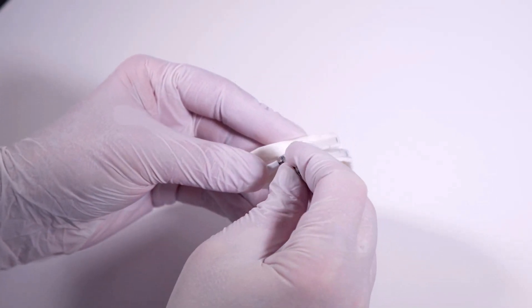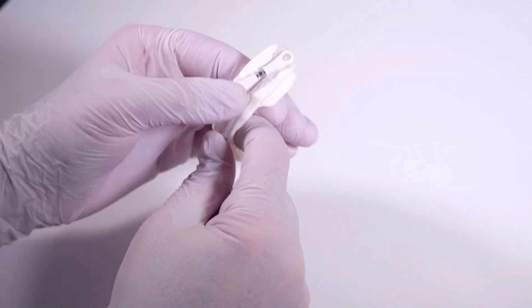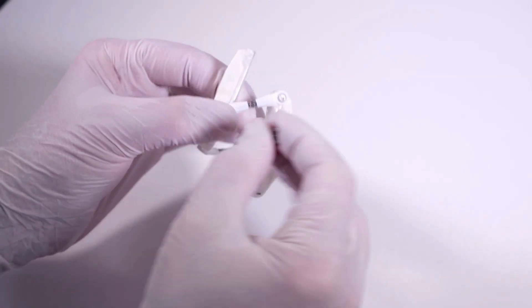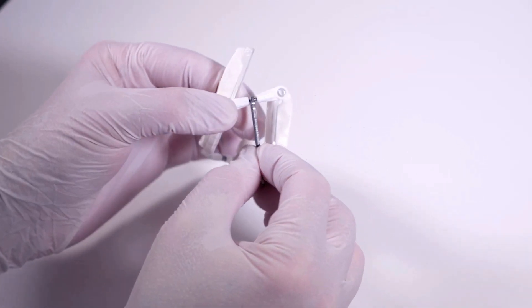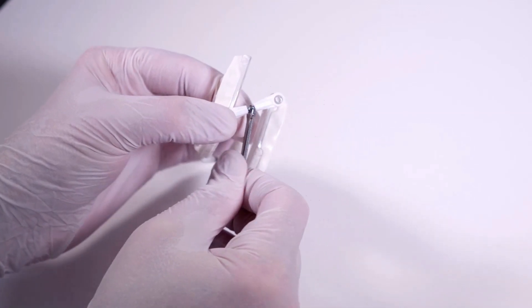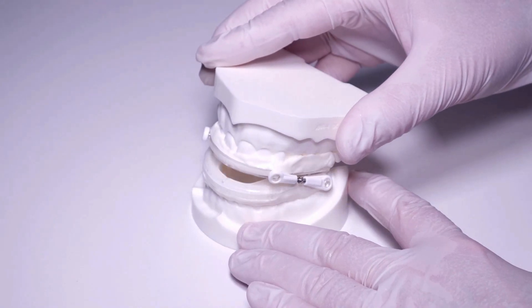Each connector has a spindle screw in the center. The length of the connectors can be altered by turning the spindle screws with the spanner. The lower jaw advancement is largest when the screws are screwed in completely. It's important to always turn the two screws evenly and symmetrically to ensure the connectors are of equal length, as mandibular joint disorders might occur with an asymmetric adjustment. The patient can now insert the Somnogard SPX mandibular advancement device in the mouth and check its fit.